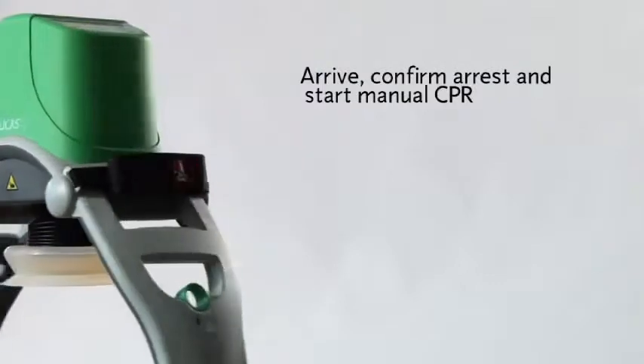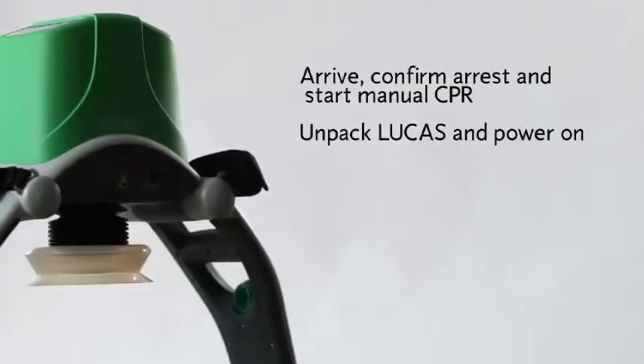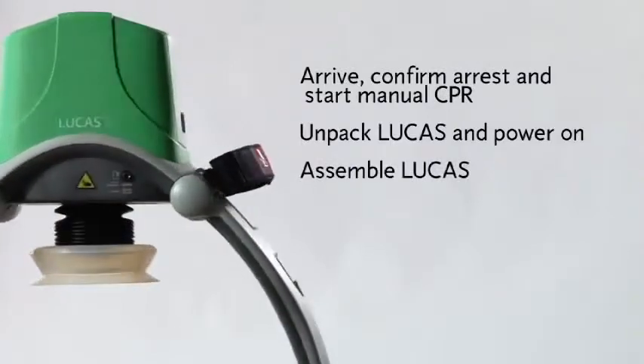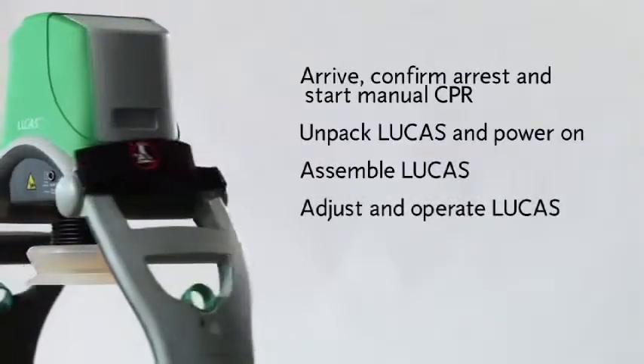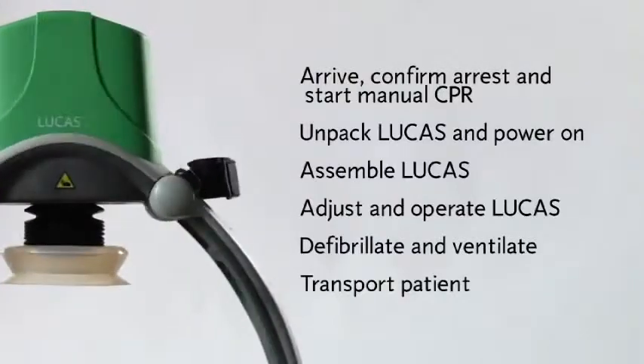Here's a quick summary: arrive, confirm cardiac arrest, and start manual CPR; unpack Lucas and power it on; assemble Lucas on the patient; adjust and operate Lucas; defibrillate and ventilate; transport the patient. Remember to read the instructions for use for information on cleaning, routine maintenance, and other important details such as general warnings. Thank you.